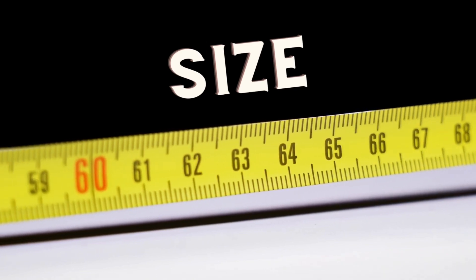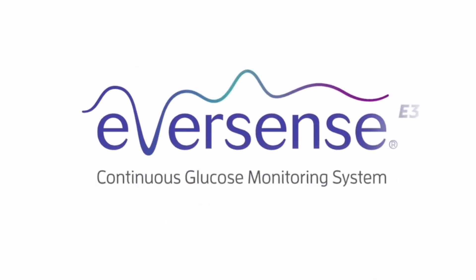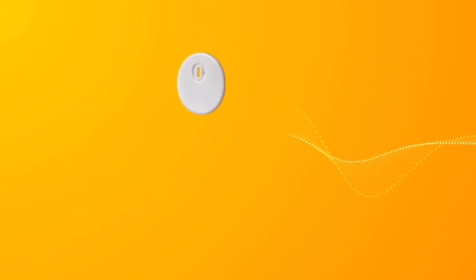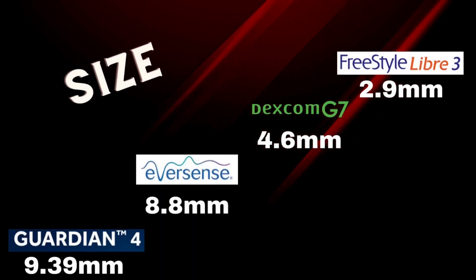Let's talk about size — these things are stuck to your body 24 hours a day, so smaller is definitely better. I'm listing thickness for each sensor, as that's the most important measurement — basically, how much is it sticking out from your body? The Medtronic Guardian 4 comes in at 9.39 millimeters thick. The Eversense is a bit thinner at 8.8 millimeters, and uniquely it's the only CGM that can be taken off at any point using double-sided adhesive tape. The Dexcom G7 is much smaller than its predecessor, coming in at just 4.6 millimeters. And the Libre 3 is the smallest on the market — comparable to two pennies stacked — at just 2.9 millimeters thick.